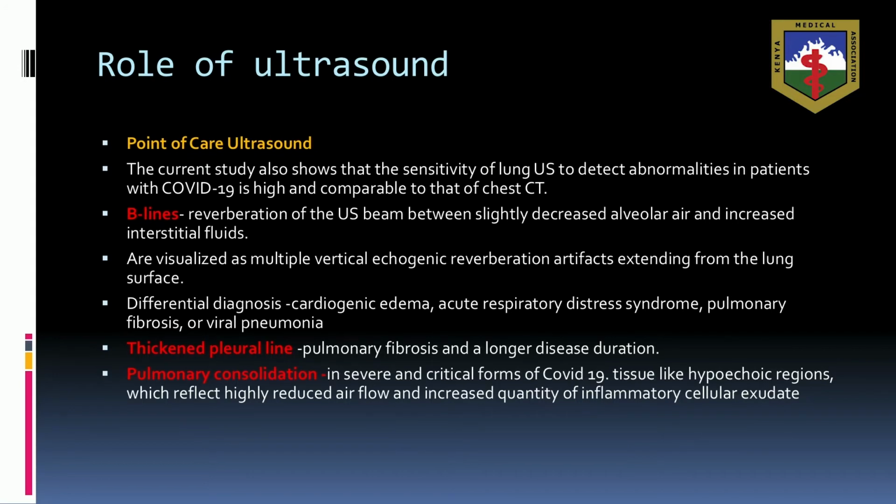Now, ultrasound. Ultrasound is actually very useful, and it's also very available. It's a very useful study, but I'll draw attention to point of care ultrasound. This is where the patient is sick, bedside, and you actually get to examine the lung. We know that ultrasound is produced by the use of sound waves, and so there's no ionizing radiation. So you actually have got no radiation risk.